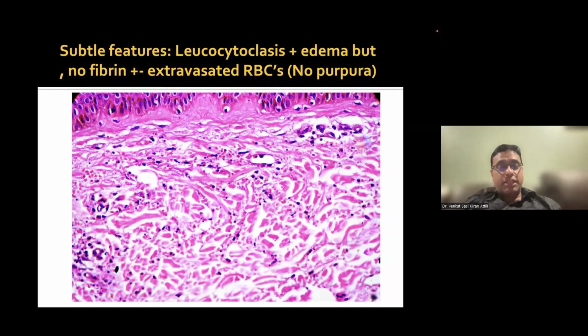It resembles urticaria both clinically and histologically, because histologically there is marked dermal edema, but there is also inflammation of the vessels. That's why there is leukocytoclasis. You can see here lots of nuclear dust, okay? You're not seeing fibrinoid vessel wall change. And that's why I said it's very subtle. In early cases, even of leukocytoclastic vasculitis, you may not see fibrinoid vessel wall change, okay?